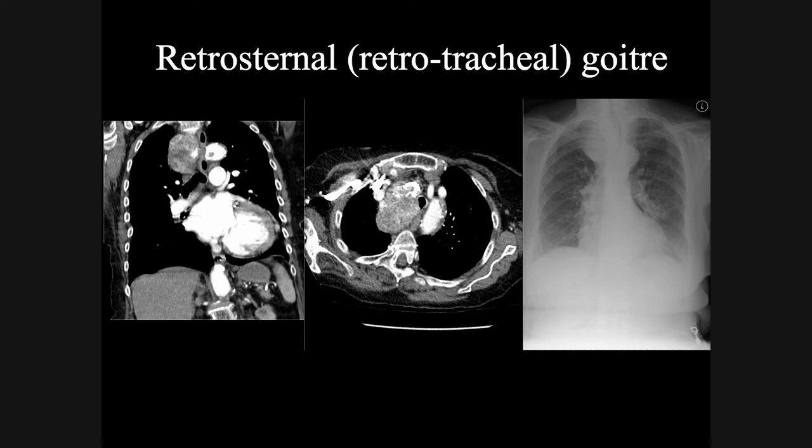This is the same patient as in the previous slide. Again you can see the sharpness just below the clavicle, and that's because this border interfaces with the lung at that point. But above the clavicle there's no anterior lung with which the mass can make an interface, and hence that's why you get fading of the lesion above the clavicle.